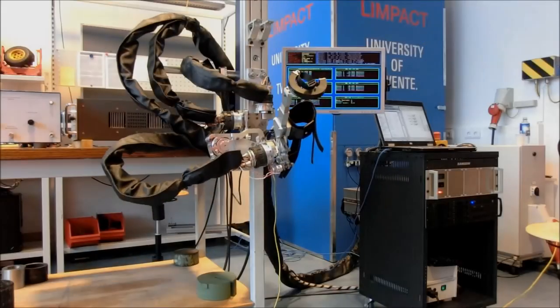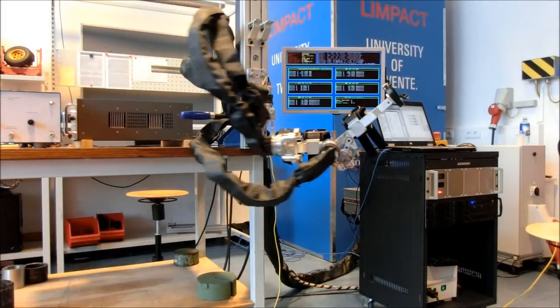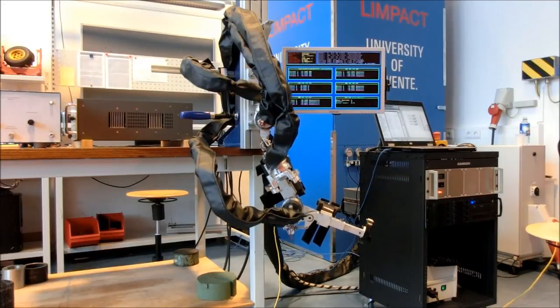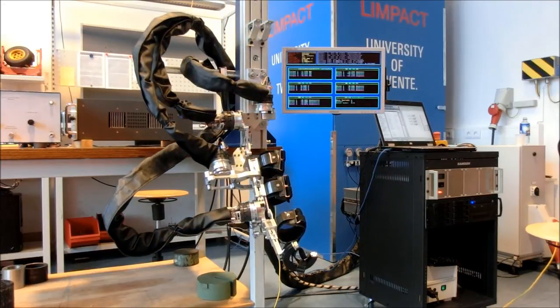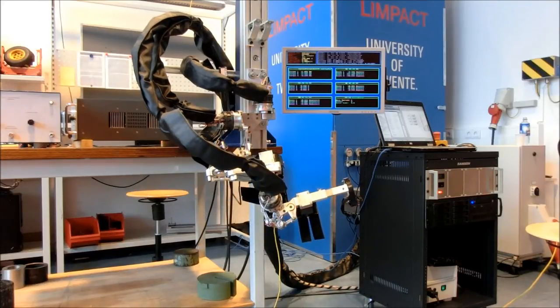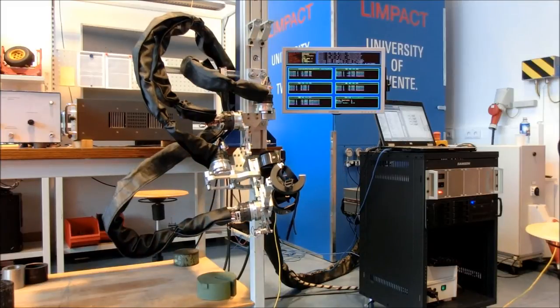The controller that was designed in 20-sim is tested on the LIMPACT. The simulation experiment is repeated on the LIMPACT setup. The tests and simulations show very similar results, both also show no sign of instability.